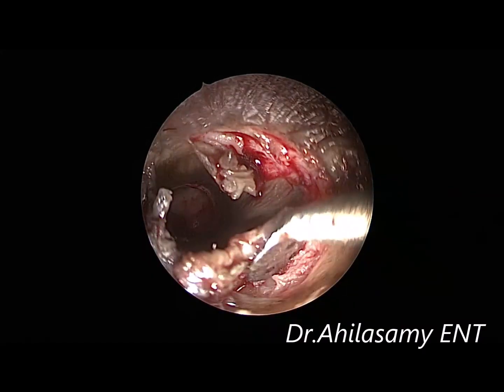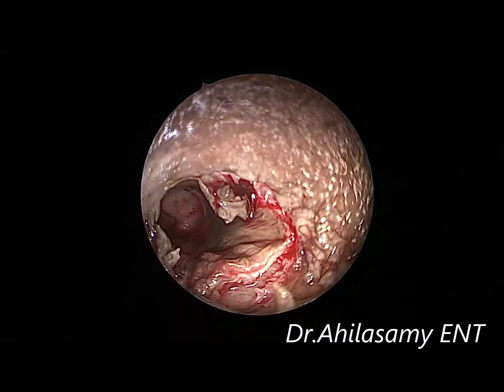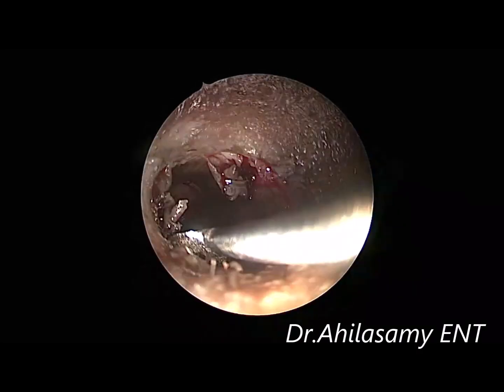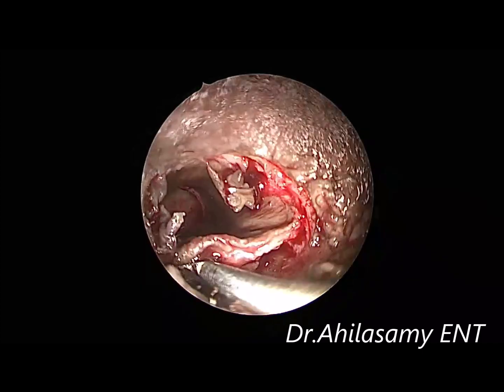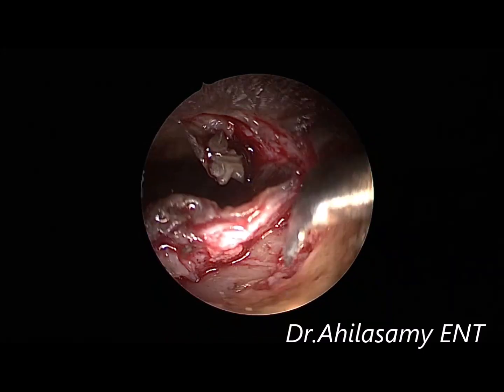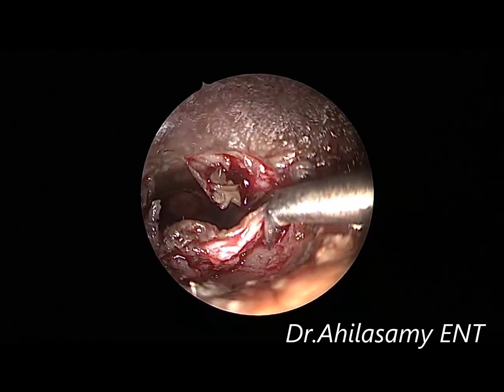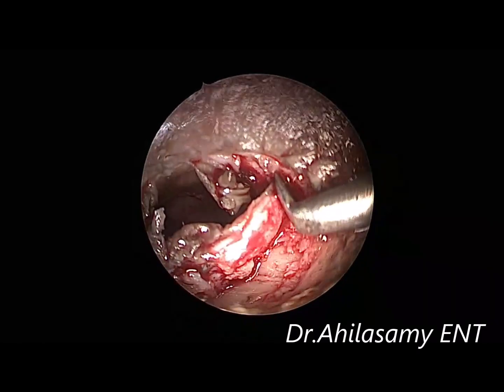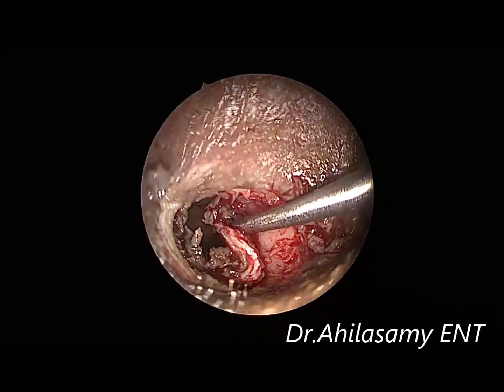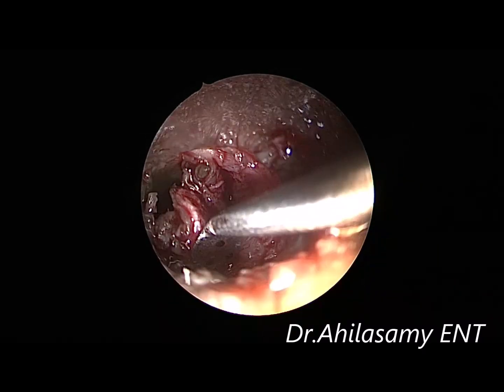A small drawback is that healing at the incision site will be a bit slow when you use my diathermy knife, and sometimes there may be granulation. If it occurs, you can use Zoleo ointment postoperatively on the granulation area. But it makes the surgery very much easier — fast, no nightmare-like bleeding from the incision site, no frequent suction or adrenaline-soaked cotton ball needed.